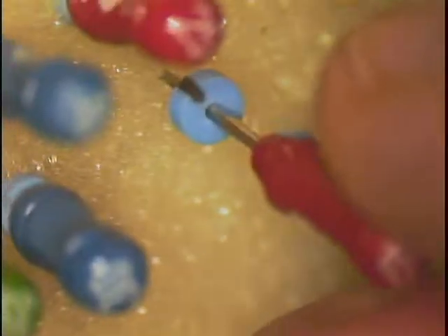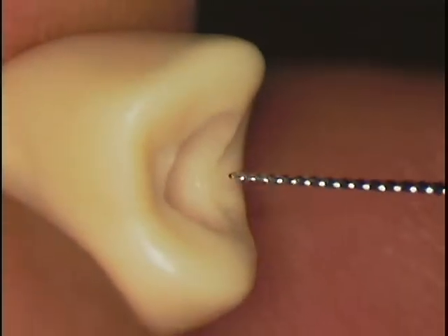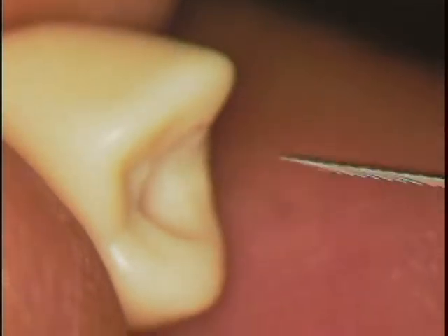So notice I'm also putting them right back in here because the sponge acts as a cleaner. So you can see, this is what those files look like blown up. See how it's wire or metal that's just twisted, and on the end is where you're cleaning the tooth. See the little debris on the end of that? That's what you're getting out of here. The walls of this are very sharp as well. The twist of this metal cuts also on the side, and many endodontists will flare more by just using the side of the file. Today they're all rotary.